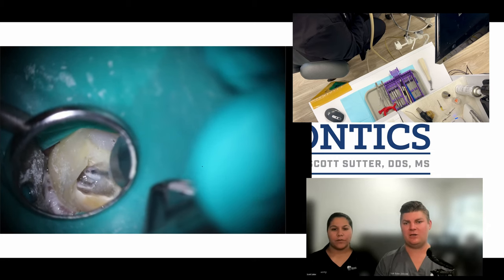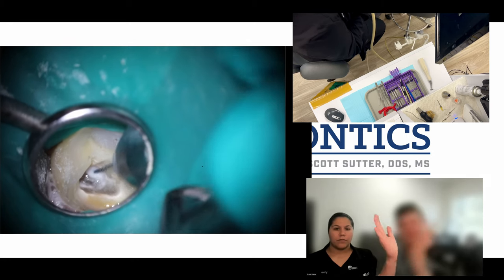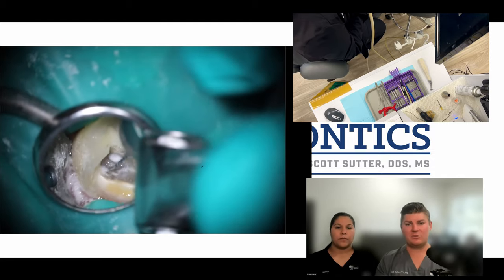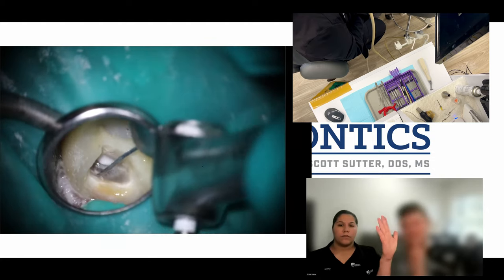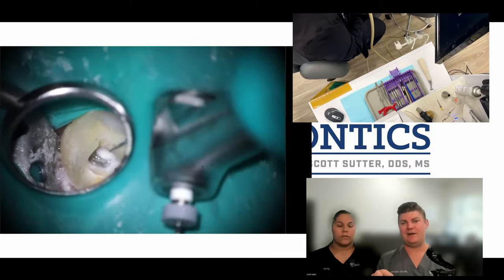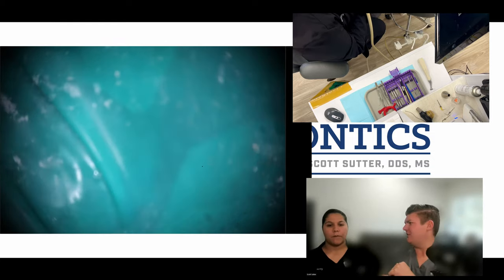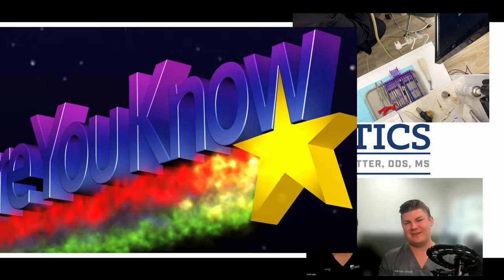This ended up being a type two system. Right where those two come together at the Y, it can be a little tough to get past that, so using smaller files is a trick I use to go around it. One tip I haven't talked about before: with martenic files, if they start to bend on you, you can actually put them down a straight canal — the heat stiffens them back up again. It's nice to just do a quick pop into the palatal canal to stiffen it up. So we're all learning together.